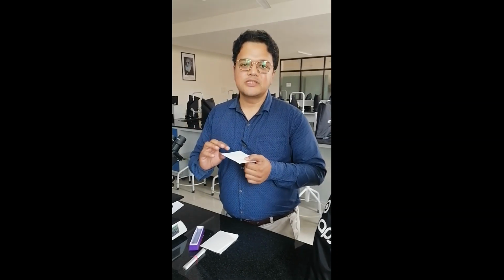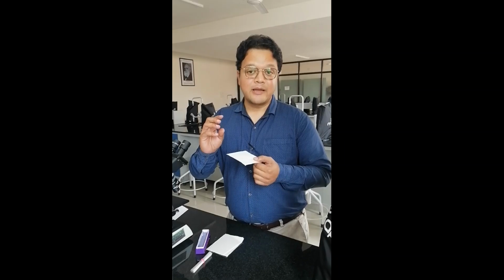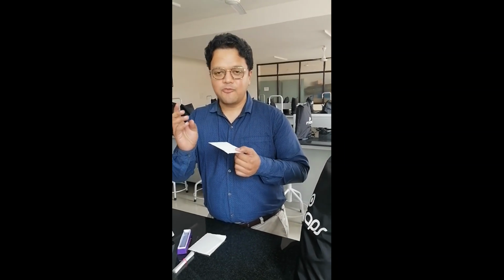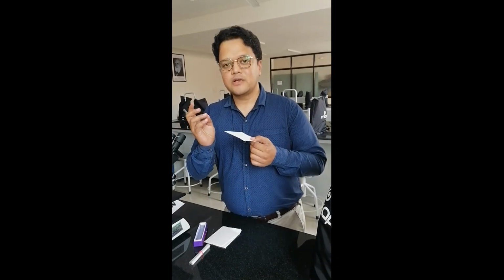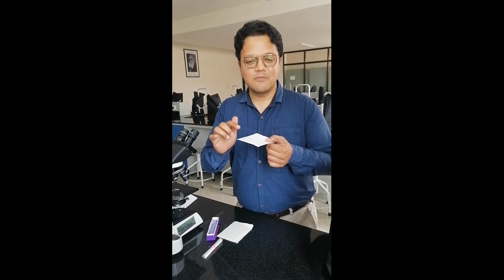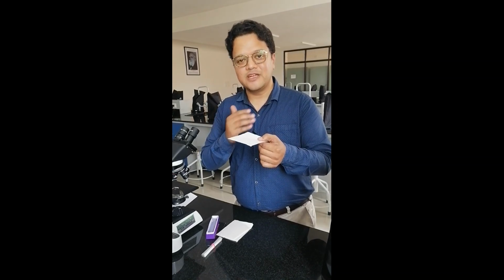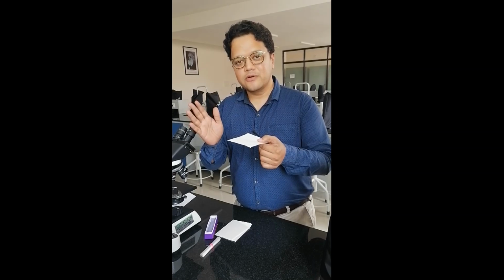Now another common mistake you make during the procedure: the time starts as soon as you have pricked your finger, and whenever you put the first blot, that is going to be 0 seconds. Some of you make a mistake that you mark that as 15 seconds. No, the first blot is 0 seconds and you're subsequently blotting every 15 seconds till the bleeding stops.